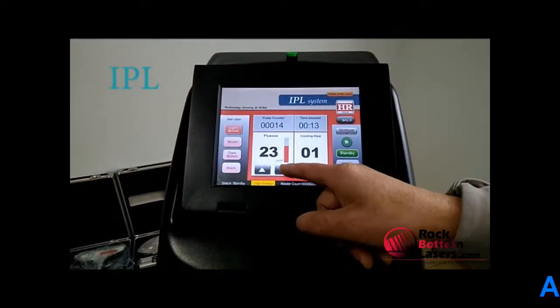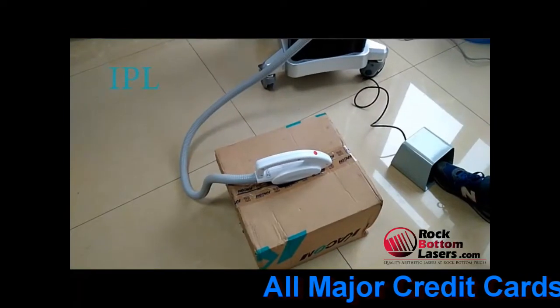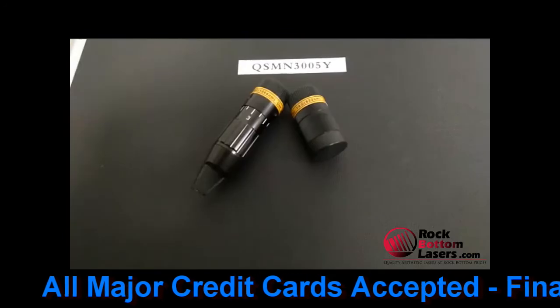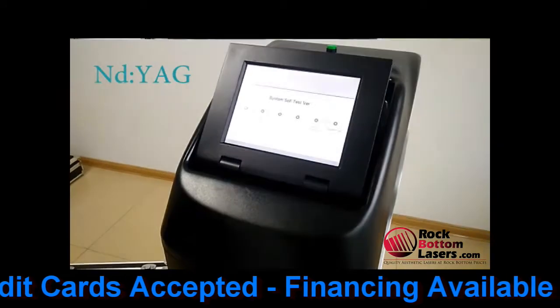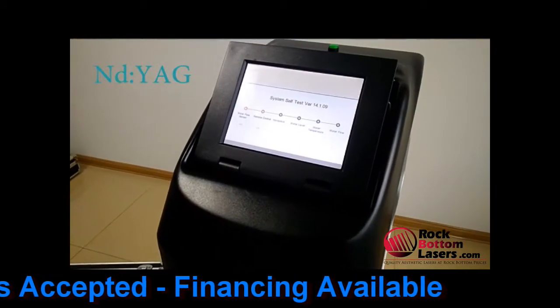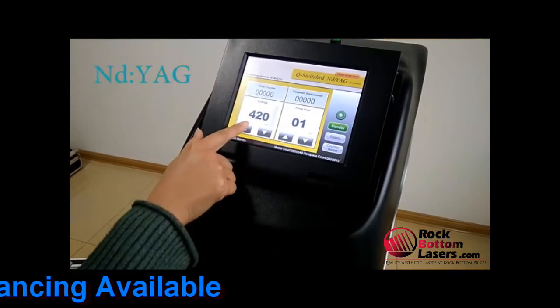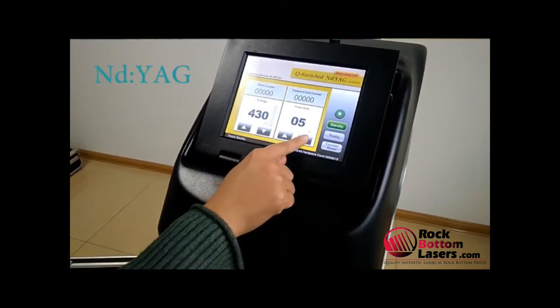It allows you to have a quick ROI on the equipment and it is FDA approved. It's manufactured by Elmen, which has been in the industry for a number of years now. Very high quality, and it does come with one full day of training as well.